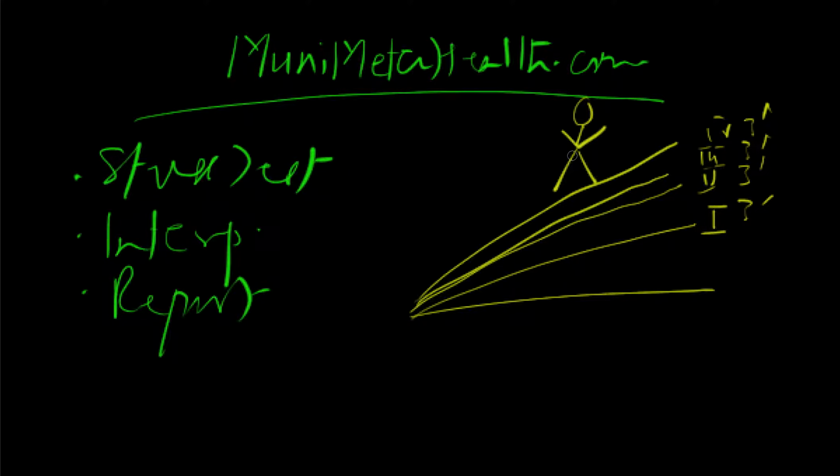Number two, obviously the patient has to perform maximally, so therefore should be in comfortable attire, preferably in shorts if you can, and of course a very light shirt. This way the person may be sweaty, but you want to be sure that the person is not exercising very uncomfortably either. So you want to have the maximum support for the patient. Two, you want to have the patient on an empty stomach and then perform maximally.